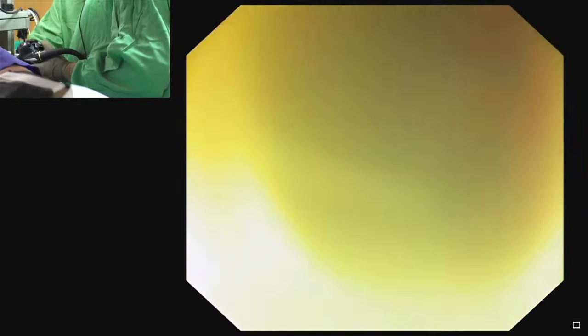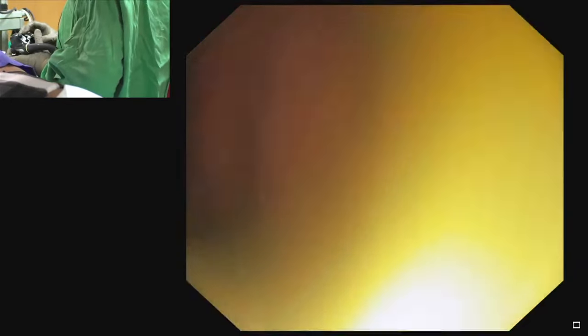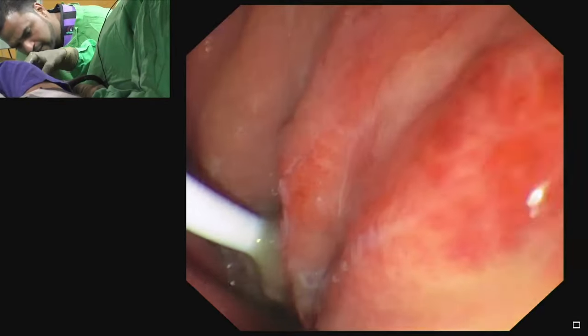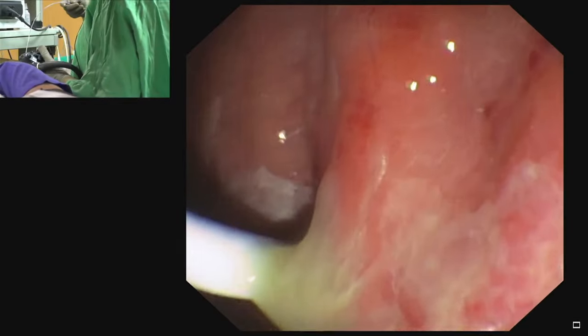We pass the cannula and try to go along the previous stent. With the side-view endoscope it may be easier to get the correct direction toward the walled-off necrosis. We can use fluoroscopy and try to pass the guidewire along the shaft of the previous stent. We trace the stent to identify the previous puncture site, using a 5 French cannula, which is readily available. Fluid is seen seeping from the puncture site.